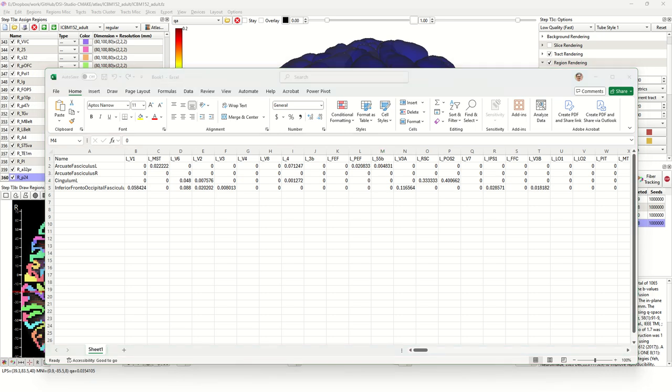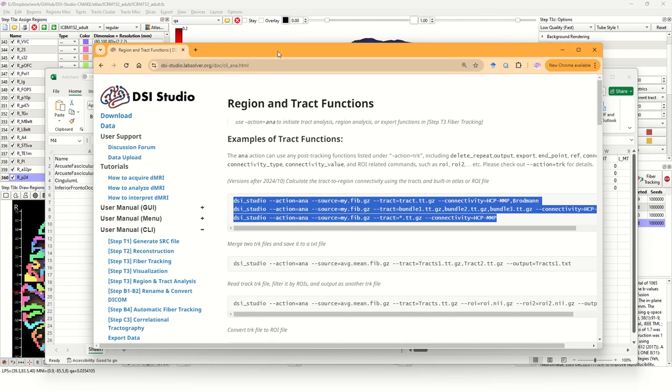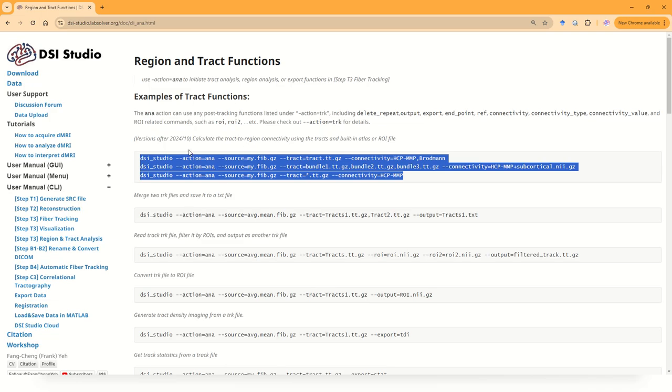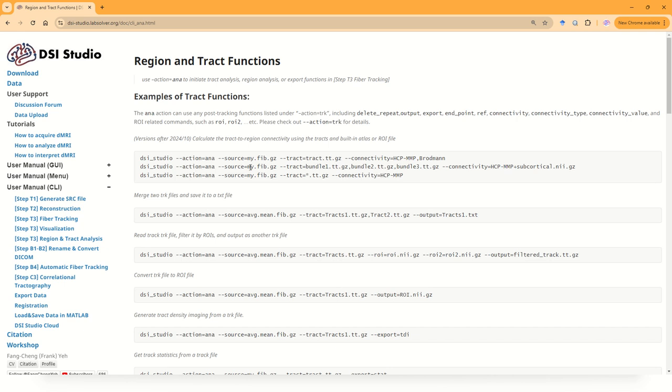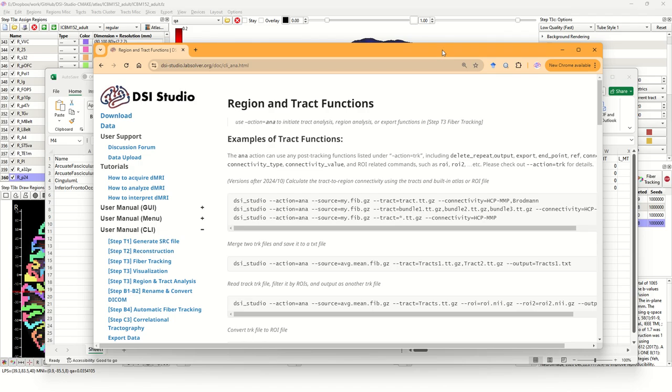Of course, we can do this in command line. You can refer to the online documentation under the track analysis function. Go to the DSS Studio website under region and track analysis. Go to this page. The first example is newly added. You could assign the FIB file of the subject. For the track, you can include all tracks that have been mapped using automatic fiber tracking. For connectivity, you can specify the name of the atlas. Here, the same as our example is HCP MMP. You can assign multiple atlases separated by comma. This concludes the function of tract-to-region connectome.